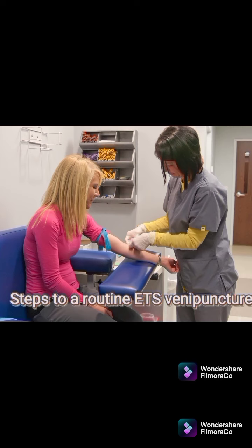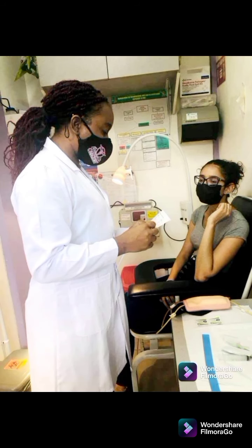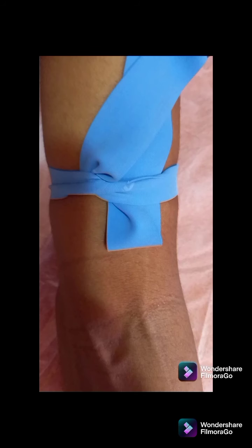Steps for a routine ETS venipuncture. Review and accession test requests. That includes the date and time of collection, status, and priority. Identify and prepare the patient. Verify date of birth and explain the procedure to the patient. Verify diet restriction and latex sensitivity. Sanitize hands and put on gloves.